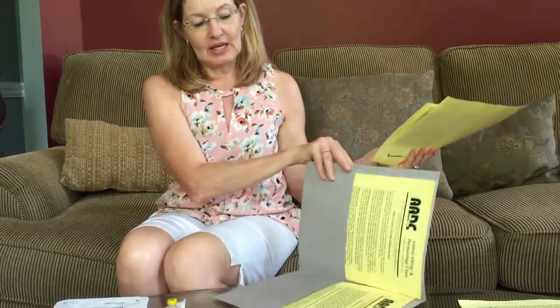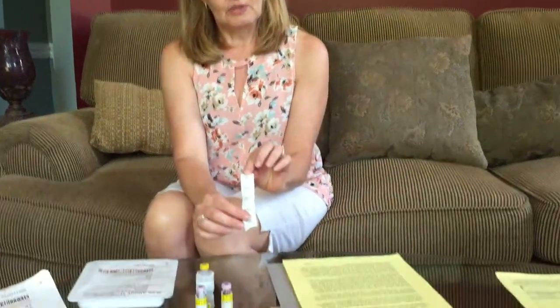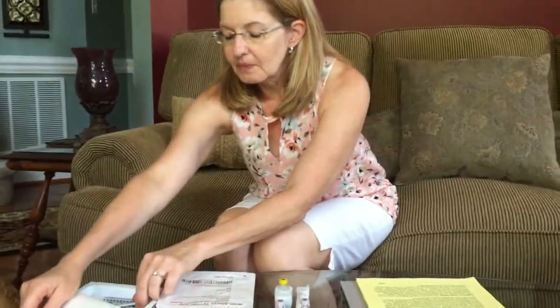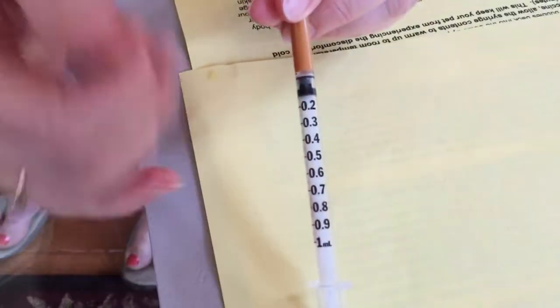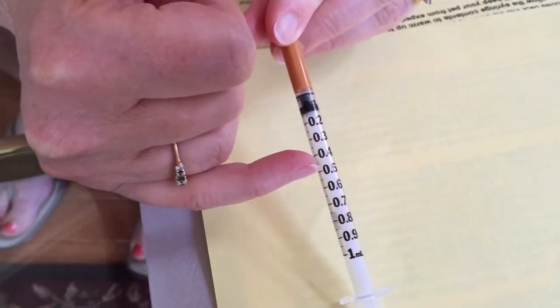You will also get a folder that has all of the handouts that you will need in order to administer the vaccine. You will also get these stickers. If you use a paper calendar, you can put them on your calendar to remind you when to give the vaccine. You are going to be needing a syringe. These are 1 ml syringes, and you can see the marks: 0.2, 0.3, 0.4, 0.5. When you administer the vaccine, you start with the lowest volume and you gradually work your way up.